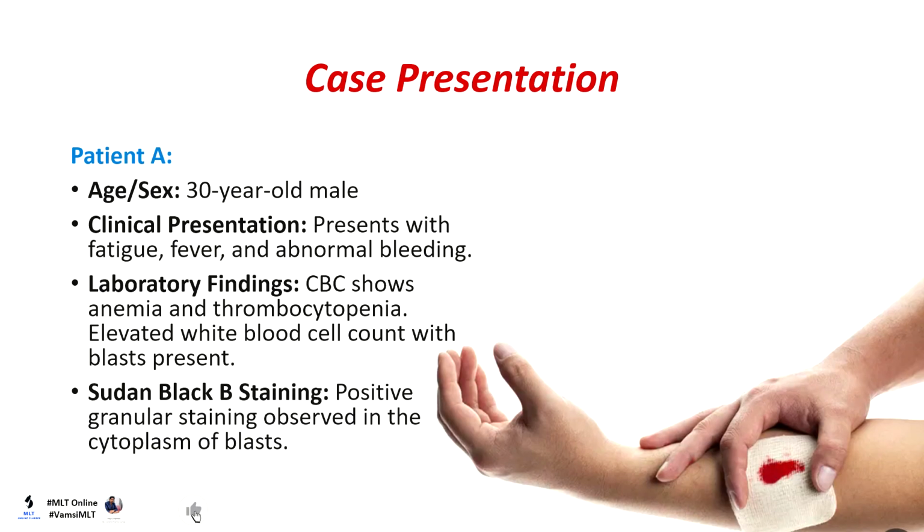Case presentation. Patient A. Age/sex, 30-year-old male. Clinical presentation: presents with fatigue, fever, and abnormal bleeding. Laboratory findings: CBC shows anemia and thrombocytopenia. Elevated white blood cell count with blasts present.